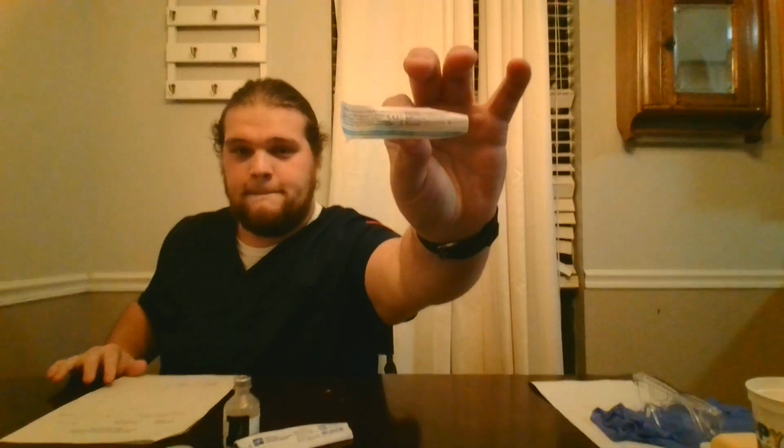Again, back to the 5 milligrams, and this being 10 milligrams per milliliter, so I will draw up half a milliliter. This calculation would need to be double checked with another nurse, so now I am going to draw up my medication. Since it is intramuscularly, I will be using a 3 milliliter syringe, a blunt tip cannula, and a 23 gauge needle. Alright, so I am going to use an alcohol pad to clean the top of the vial.